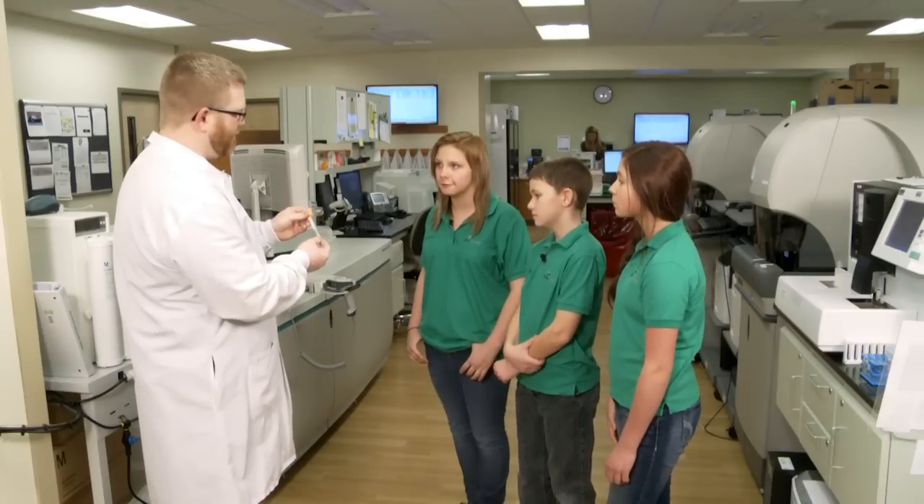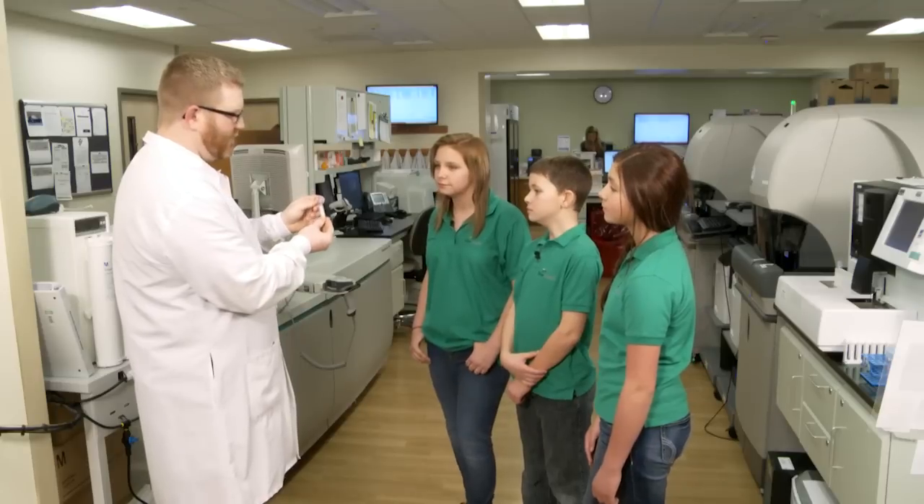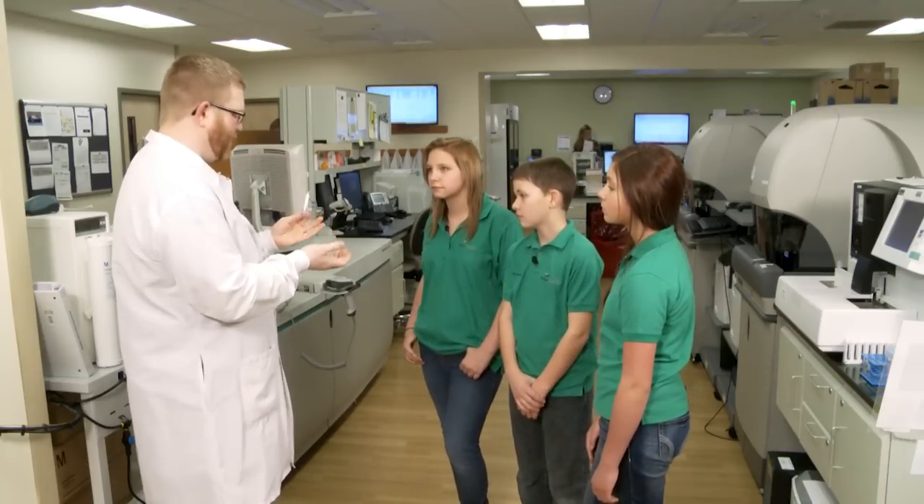Why don't you have gel in all of the tubes? That's an excellent question. Sometimes, in a tube like this one for your blood cell count, we don't want the cells to separate — we want to keep them mixed, and so the gel would get in the way.